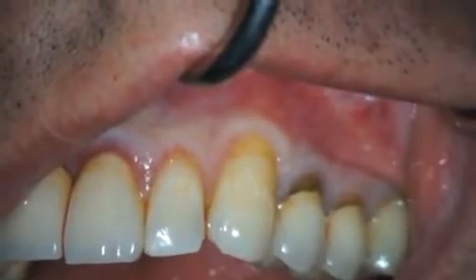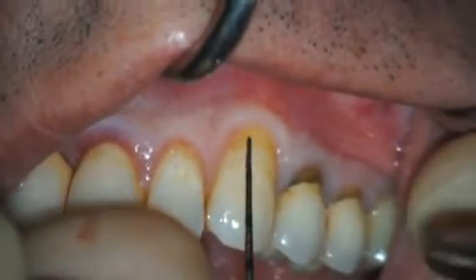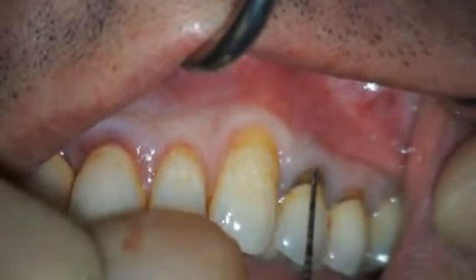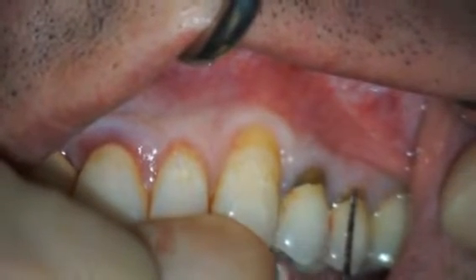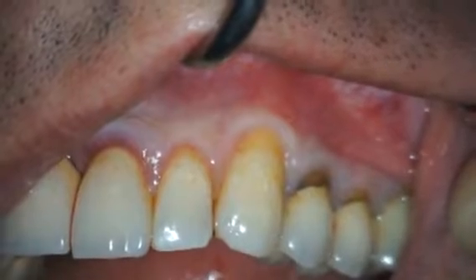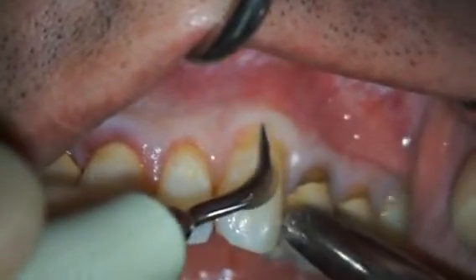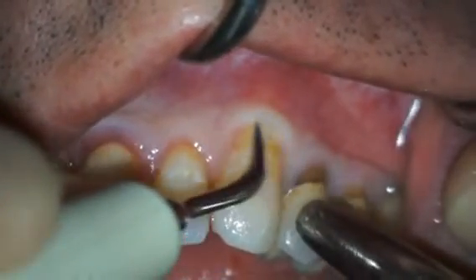The patient presents with significant contiguous Miller Class I recession defects extending from the maxillary left canine to the maxillary left second premolar. In conjunction with a minimally invasive tunneling technique, the surgeon will place mucograph collagen matrix and coronally advance the gingival marginal tissues to cover the denuded root surfaces.